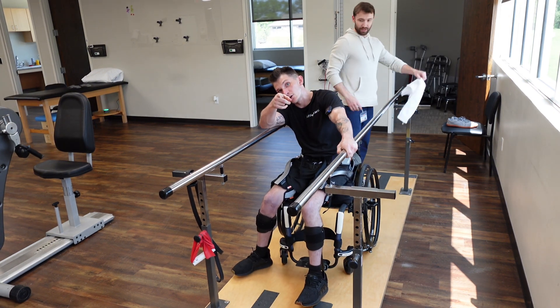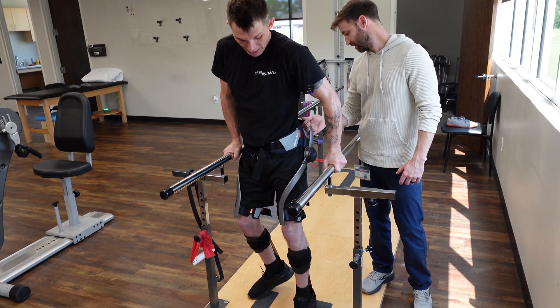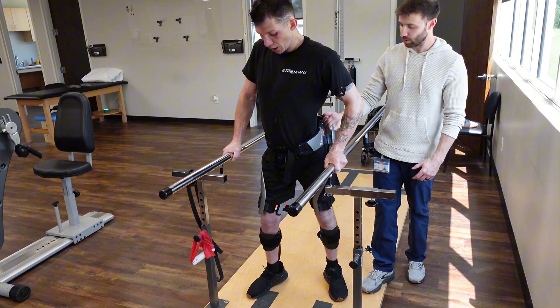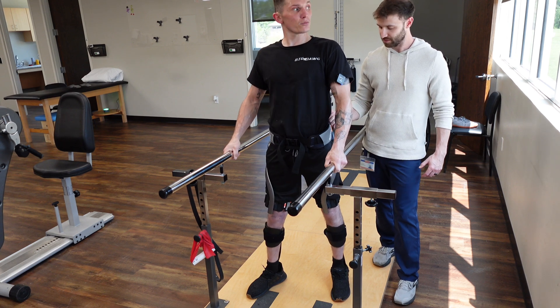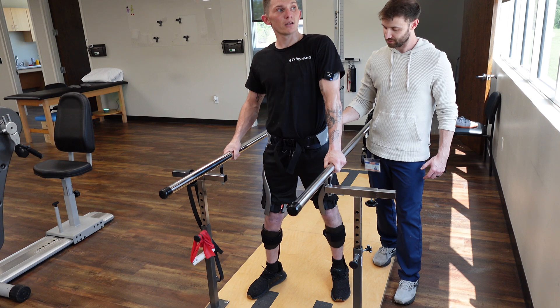Great investment. Huge shout out to everyone who donated. Whatever that last walk was, it was better. That kind of forward trunk lean — that's what I'm trying to think of. Keep my glutes engaged, leaning and trying to get that knee drive.